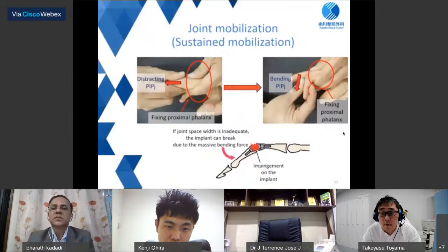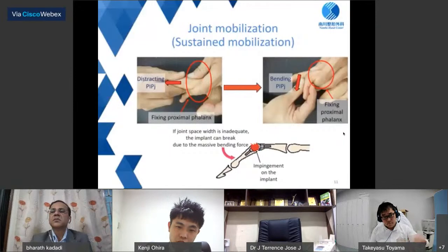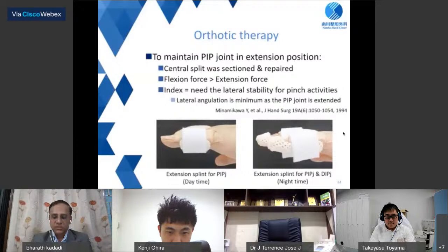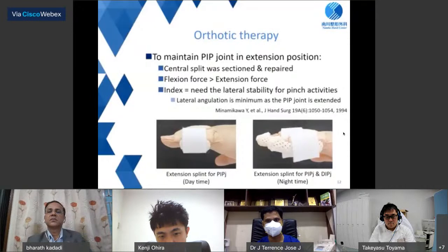This slide shows sustained mobilization, one of the joint mobilization techniques. Holding the proximal phalanx steadily, gradually increasing pressure on the middle phalanx is applied to flex the PIP joint. If the joint space is inadequate, the implant can break due to the massive bending force. The PIP joint should be maintained in extension until soft tissue maturity. In general, flexion forces in digits are stronger than extension. Moreover, the central slip was sectioned and repaired in order to insert the implant. For the index finger, or a case with ligament release, it requires more careful observation of its lateral stability.